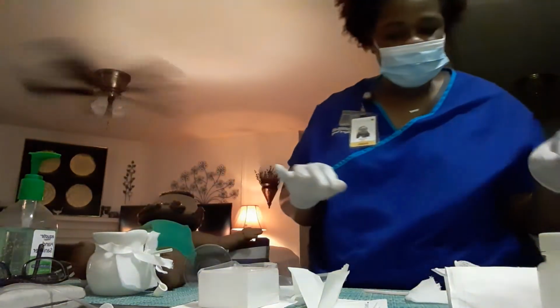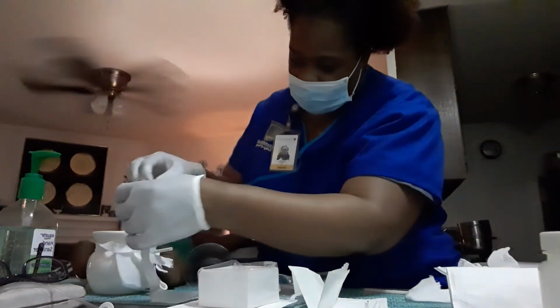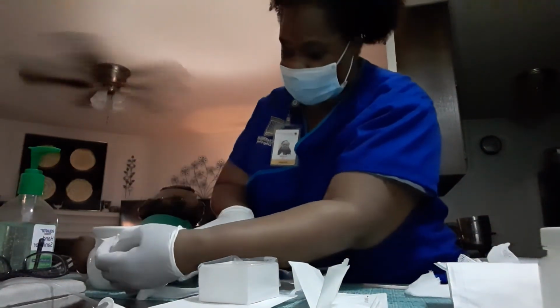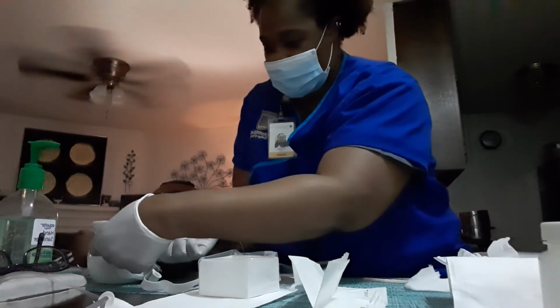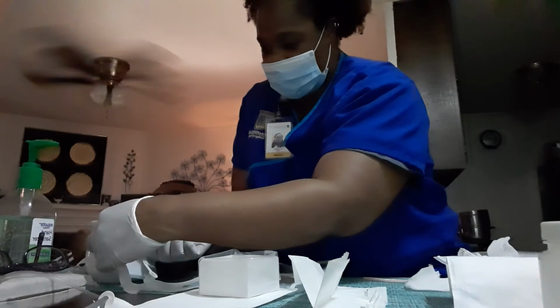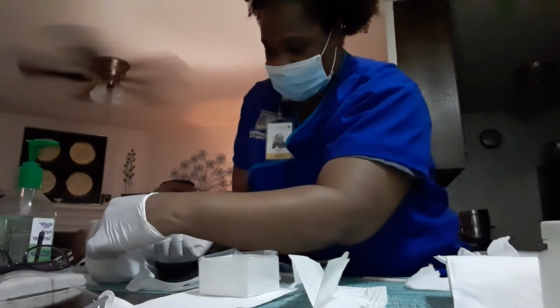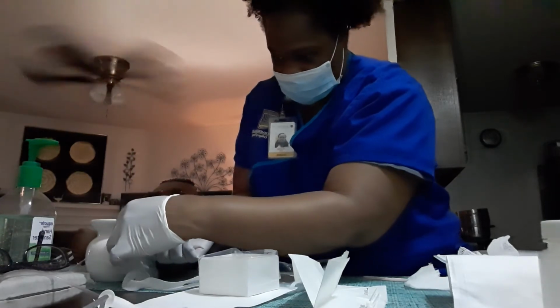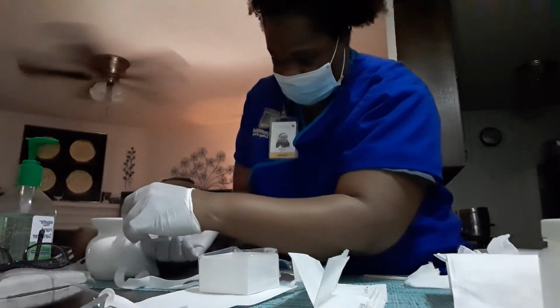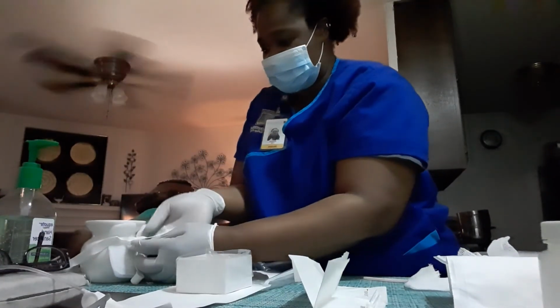And I just cut my trach ties in half and made 2 trach ties. So I do have a second trach tie. I'm gonna try to do this. I would hold the trach, and I'm gonna pull out on this side.